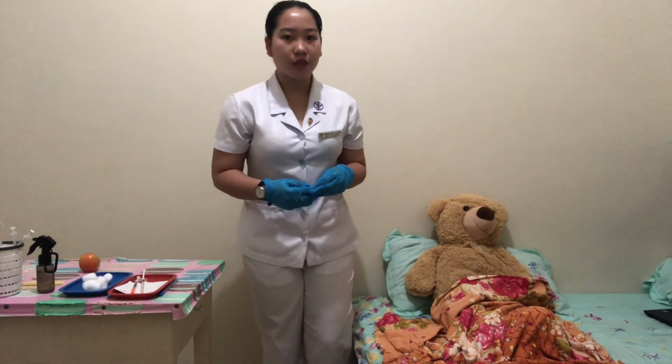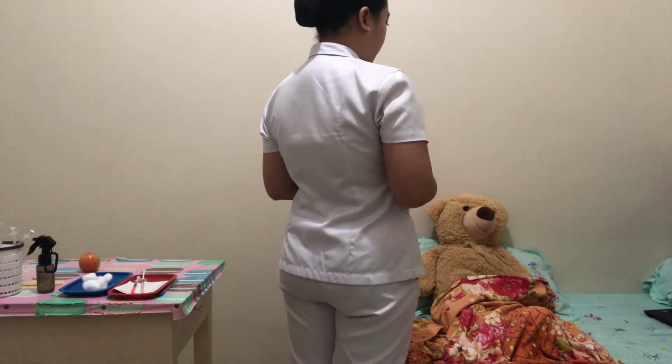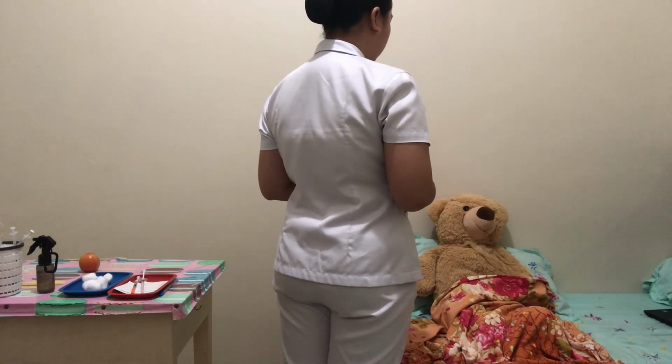And now I will explain the purpose of the medication and how it will help the patient. And I'll start administering through the subcutaneous injection. So I'll be administering insulin. So insulin is to control the blood sugar since the patient has type 1 diabetes. So ma'am, I'll be administering insulin. So this is because you have type 1 diabetes. Will that be alright?